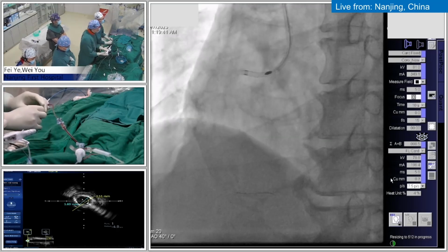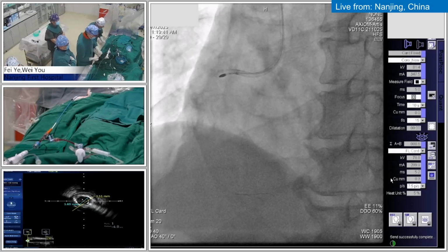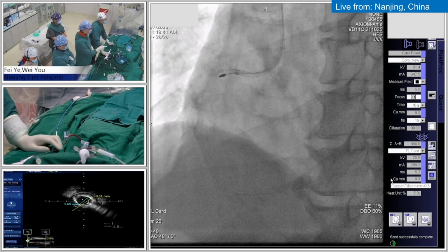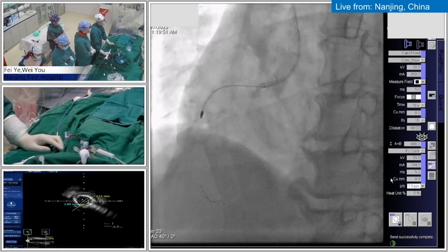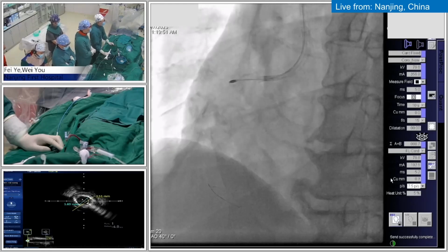Okay. Low speed. Low speed. Okay. I will send a little bit of the burr. Okay. The high speed mode. Okay. High speed. Okay. Increase the speed. Okay. 160,000. Enough. 5 seconds. 10 seconds.